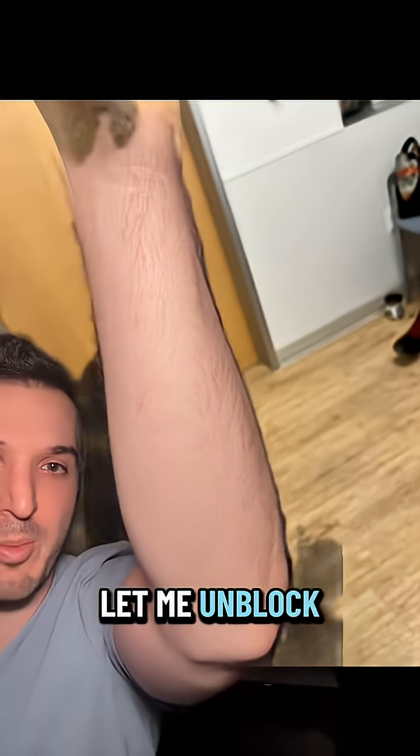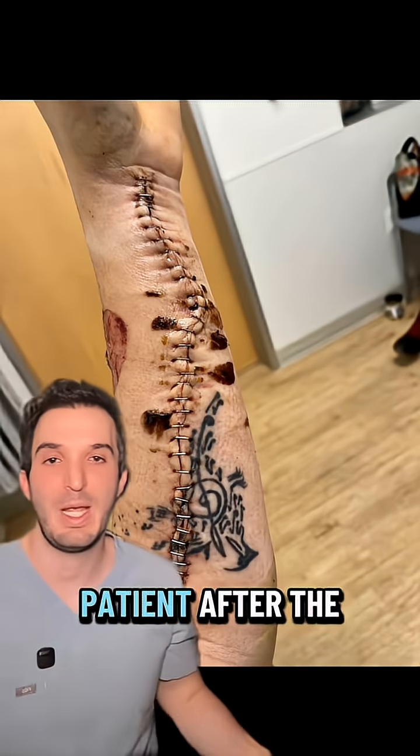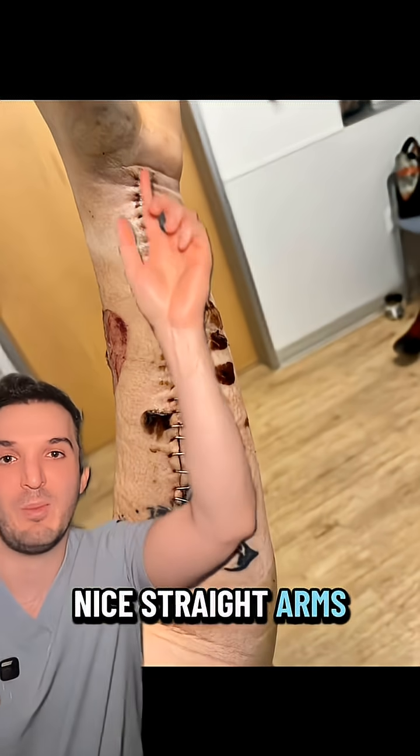Graphic picture warning — let me unblock it. Here is the patient after the second repair: skin staples, nice straight arms, some bruising up there.